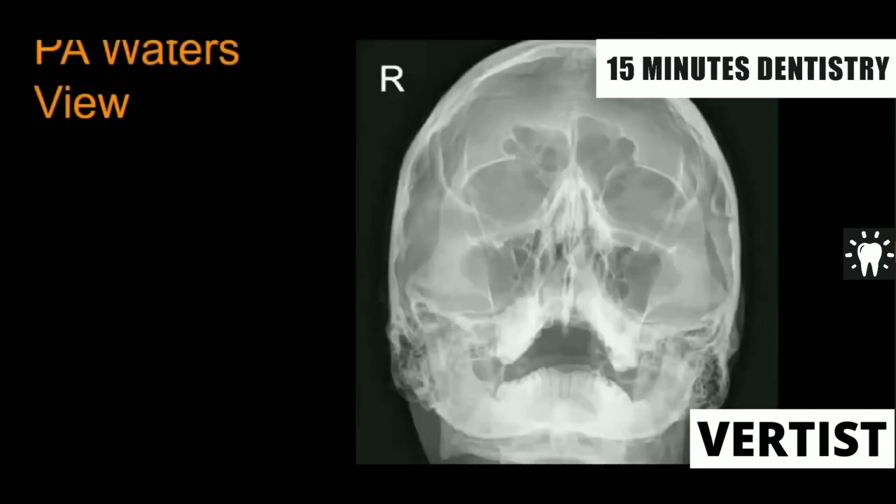PA Waters view, this is also called a PNS view or the paranasal sinus view. In it we see most of the sinuses, almost all the sinuses are seen. Okay, we take it for the maxillary sinus.